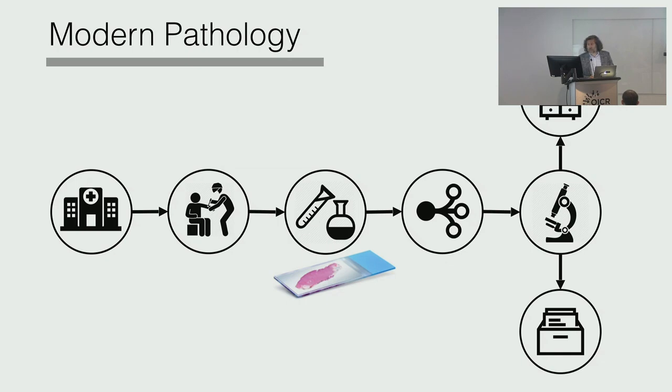And it was really difficult in the early 90s to detach radiologists from the film. You would hear the argument, "I want to touch the film." So why do you want to touch the film? The image is on the screen, just look at it. But the fundamental difference for the pathologist is that the glass slide is there, the block is there, it doesn't disappear. So it's a fundamental difference with radiology.